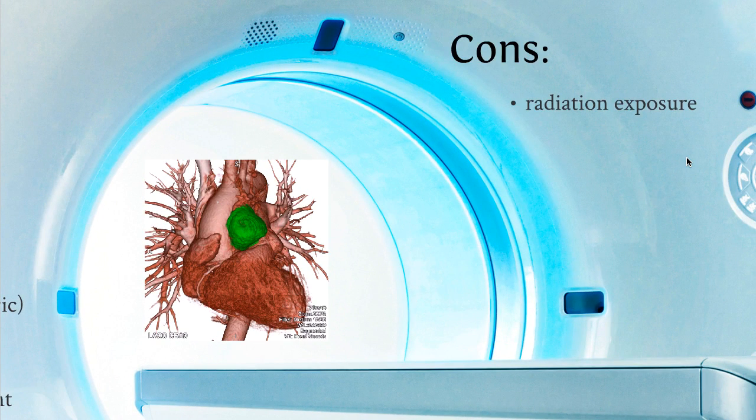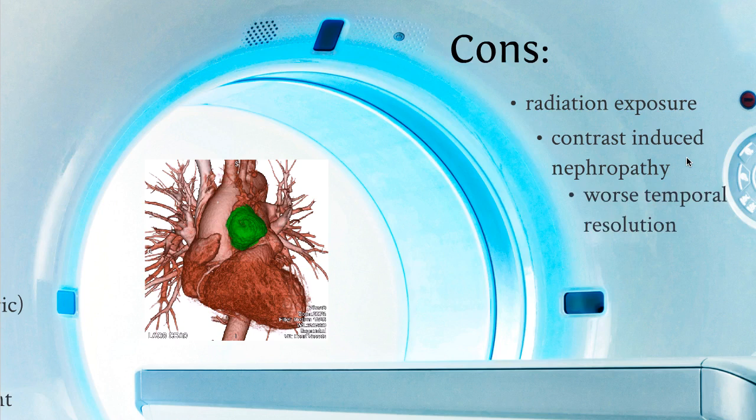Some of the cons is radiation exposure. This is a theoretical risk. It hasn't been proven that CT or diagnostic radiation causes radiation-induced cancers with diagnostic levels of radiation, but it's still something we think about and we try to give the patients the least amount of exposure possible. Also, there's the potential for contrast-induced nephropathy. This is a topic that's recently been debated, and the literature has shifted on this, but we still talk about it. Also, worse temporal resolution. We talked about this a little bit in the previous slide, and I'll show you an example of that.